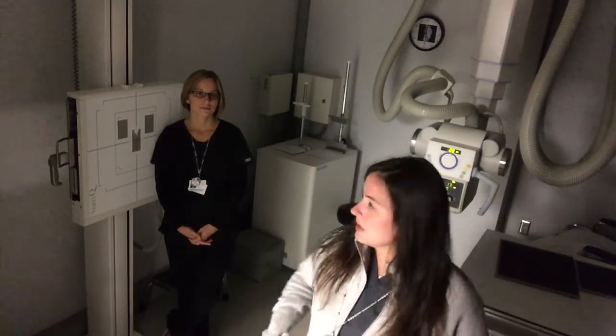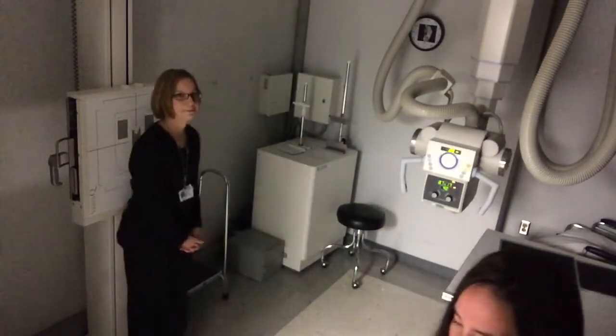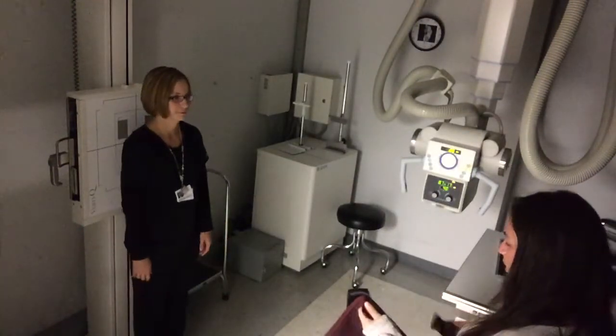In this video, we will be doing the instructions on how to perform a C-spine exam. We will be going through the AP, open mouth, and lateral projections, 3 projections for this. So I'm going to start with Ms. Skaggs as my patient here. I will have her with her back up against the board, and we'll do the AP and open mouth first.